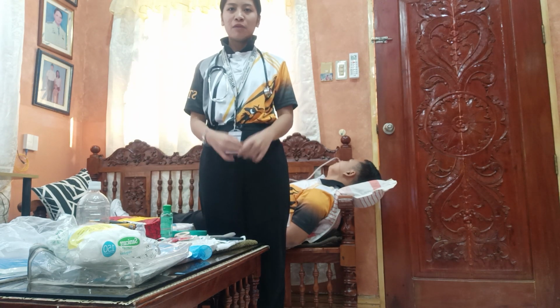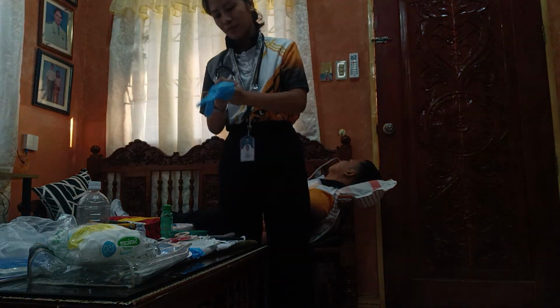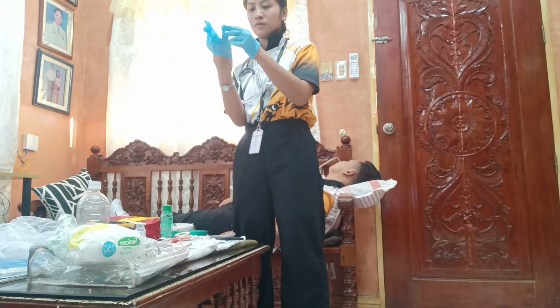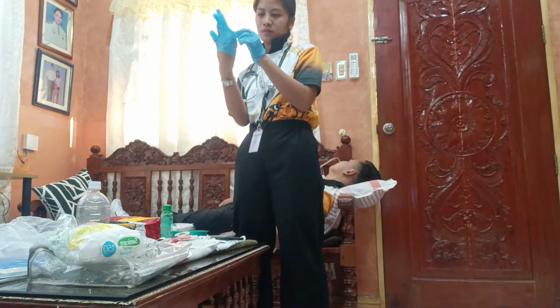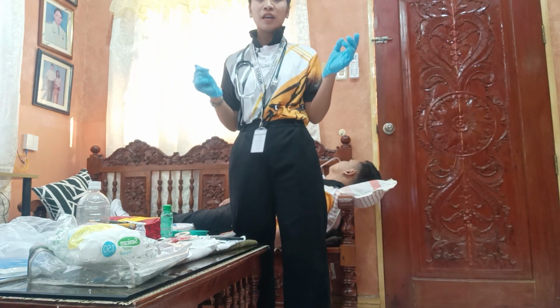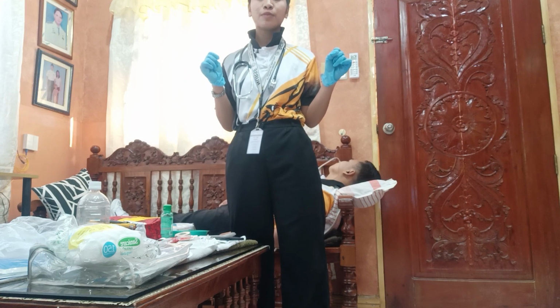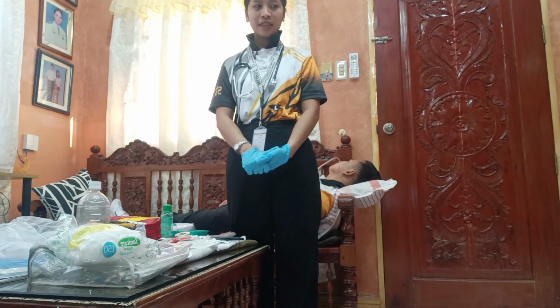And after po nun is I will put on clean gloves. After ko po magput ng gloves is i-clamp ko po, clamp the tube and remove the syringe, cap the tube or attach tube to the suction according to the medical order. So, suction provides for the decompression of the stomach and drainage of the gastric contents.